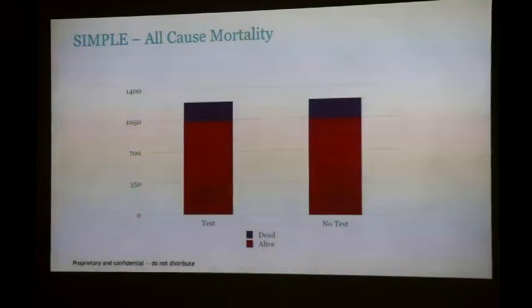You mean to say if I do have high impedance, it's not where I have the lead implanted, it's something that has to do with the lead itself? The lead is either broken or it's in calcified tissue, which is very, very rare. Those are the two cases. Or it's in air. So actually, I do move the lead only to have better sensitivity, better thresholds. That's it.